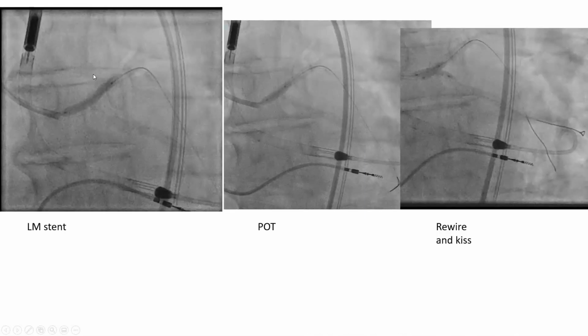Then they deploy the left main stent, and we rewire through one stent layer. That's the beauty of a perfect T or nanocrush. Or if you had done TAP also, we only recross once through one stent layer, and we do kissing balloon inflation. The standard technique for kiss is sequential kiss. So you do high pressure inflation of each balloon sequentially, particularly in that circ.